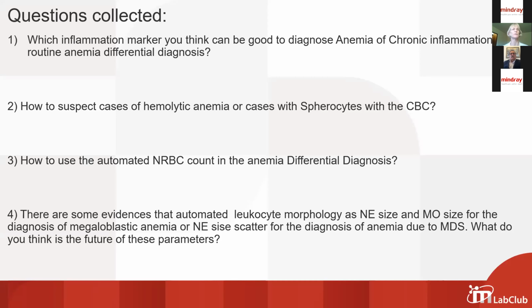I mean, you're obviously, yeah, I assume this is the question, I think. With reticulocytes, it's easier to detect hemolytic anemia and spherocytes because normally they come with a high reticulocyte count. But the question is, and you said the point, RDW, MCHC, even that they have some abnormal situations that can increase. But this is what we are working with to screen, to create a rule for when to do a blood smear, and you answer perfectly.